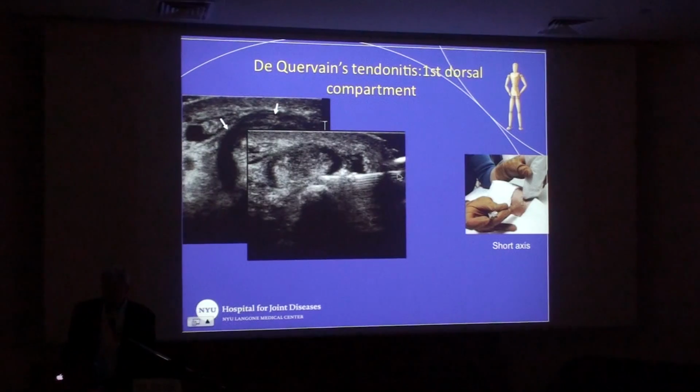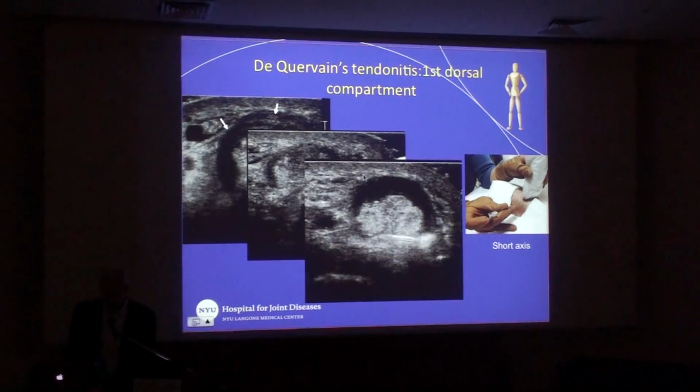And here's my needle going to the distended tendon sheath, and we do our injection, and then we have nice extension of the tendon sheath with steroid and anesthetic. To some extent, you're performing hydrodistension of the tendon sheath, which stretches out that retinaculum as well. So just by virtue of putting fluid in a situation with stenosing tendonitis, it can be very helpful.